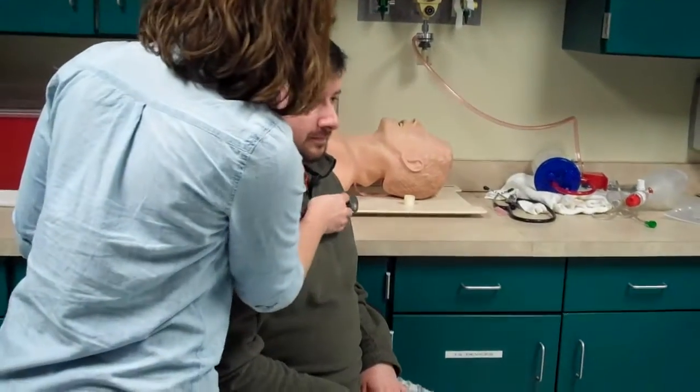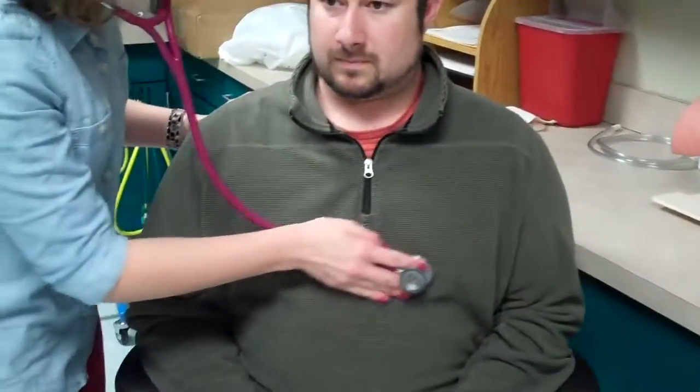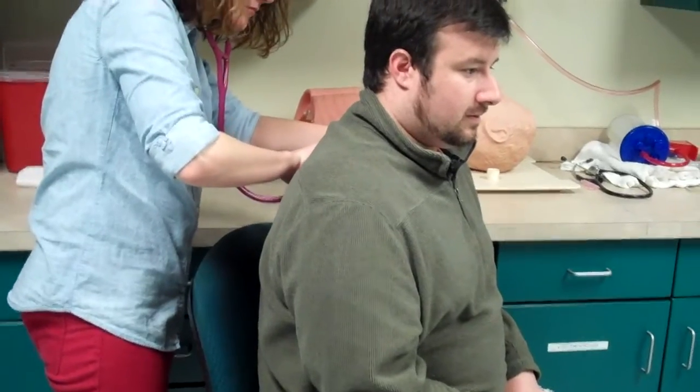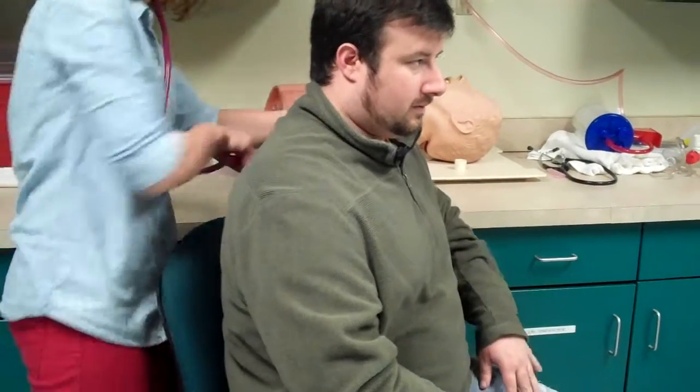And you would listen to what? Show me how you would just move the stethoscope around. I'm going to listen again. So you're going from side to side. And Daryl, how are you breathing? Normal. Through my mouth, with your mouth open, in and out. And you need to make sure you're feeling ribs. You don't want to go below the ribs. And remember, it's side to side because you're doing a comparison. If you're checking a patient's breath sounds on a ventilator, you always want to check the breath sounds on a mechanical breath, not a spontaneous breath.